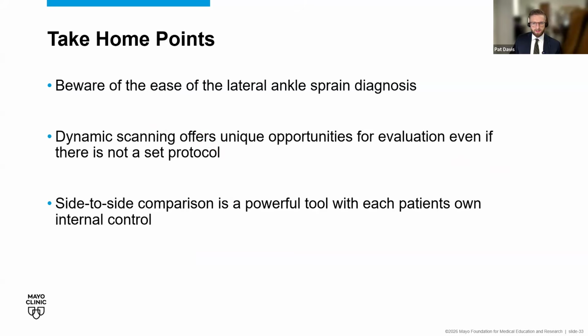However, there were a few things on exam that stood out to us as odd, which prompted further evaluation and particularly prompted doing this diagnostic ultrasound. The amount of swelling and ecchymosis he had initially in the anterior portion of the ankle was definitely concerning, as well as where he was tender to palpation. So because of this, we evaluated the anterior ankle, adding on those lateral ankle structures with what we assumed was kind of a lateral ankle mechanism.